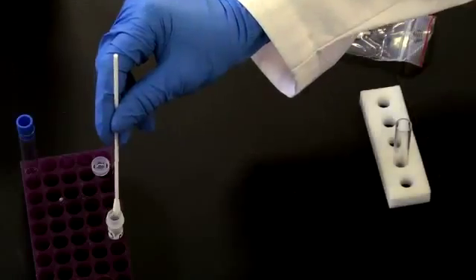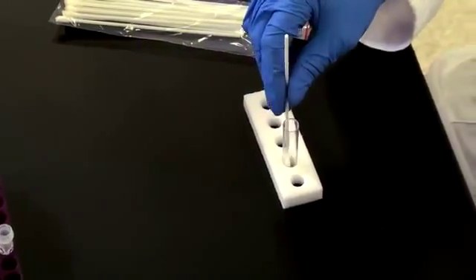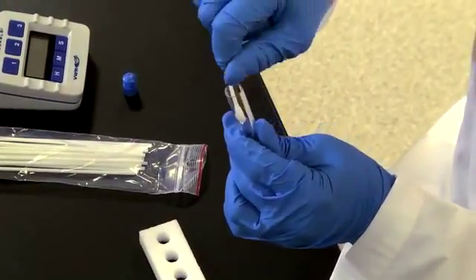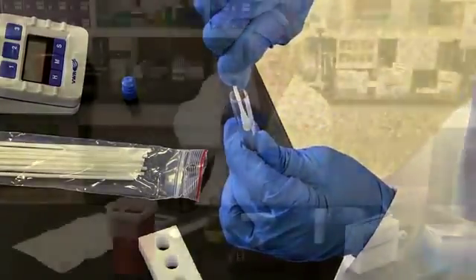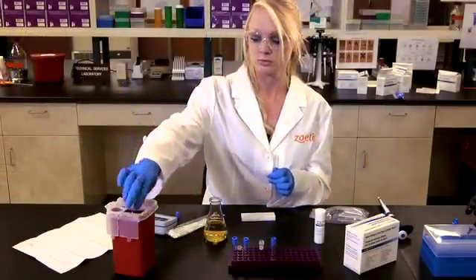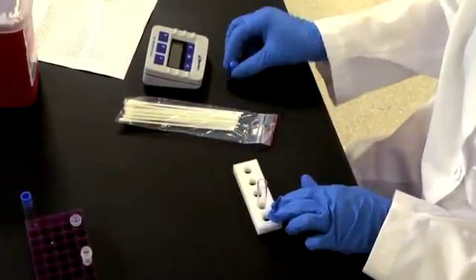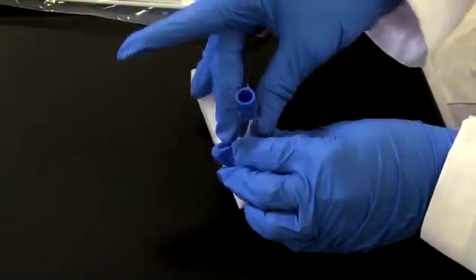Next, place the swab containing the specimen in the tube and rotate the swab 5 to 10 times in the buffer. When removing the swab from the tube, press it against the side of the tube repeatedly until no more liquid comes out of the swab. Discard the swab in an appropriate biohazard container. If the extracted sample will not be tested immediately, cap the tube with one of the caps provided in your kit and store the sample.